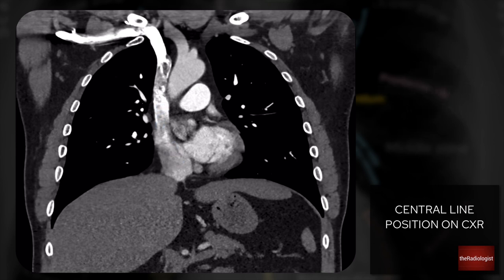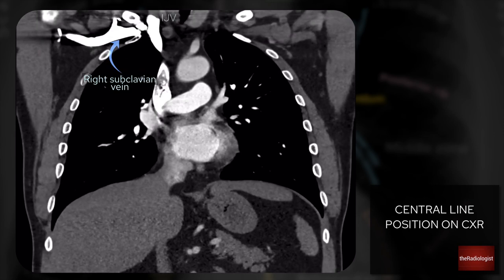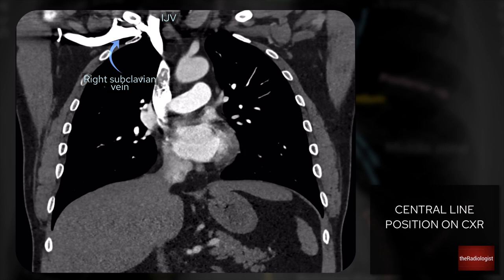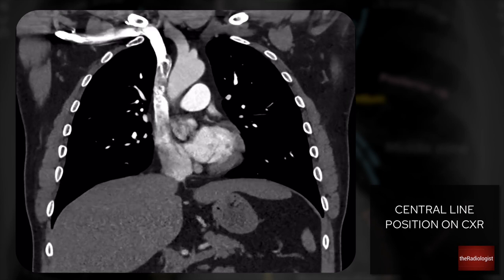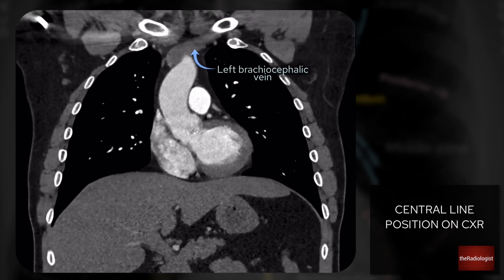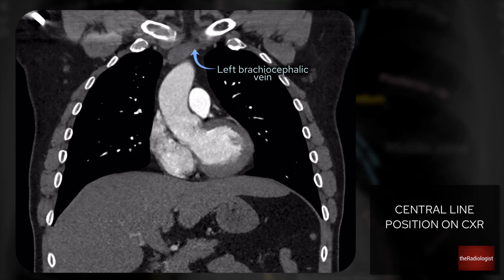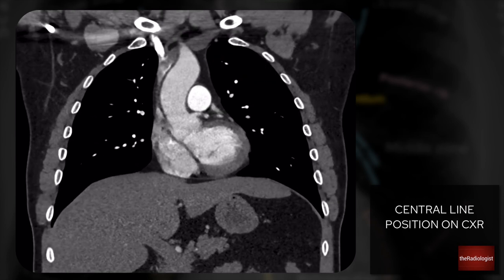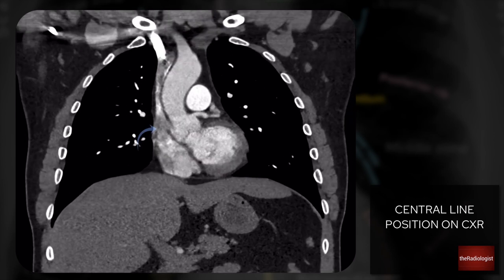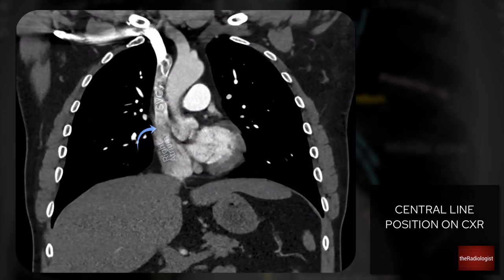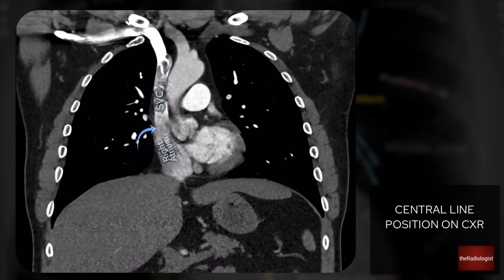On the right side, filled with contrast, is our right subclavian vein. Following that through, it goes up towards the right internal jugular vein — some lines may come in that way — and they join to form the right brachiocephalic vein. For a left-sided line, it courses through the left brachiocephalic vein, which has a little further to go, but either way they join together and head towards the SVC. The ideal position is at the junction between the SVC and the right atrium.